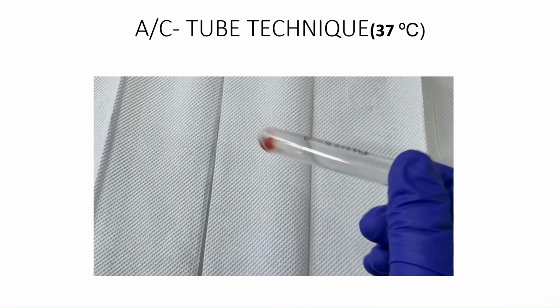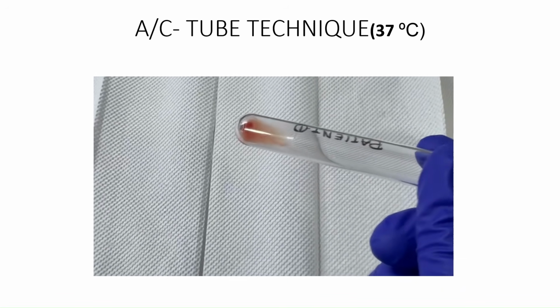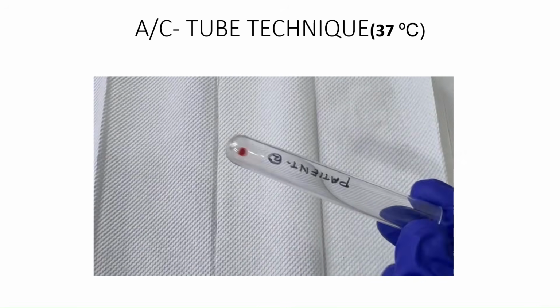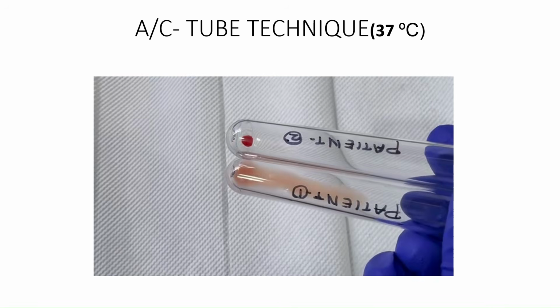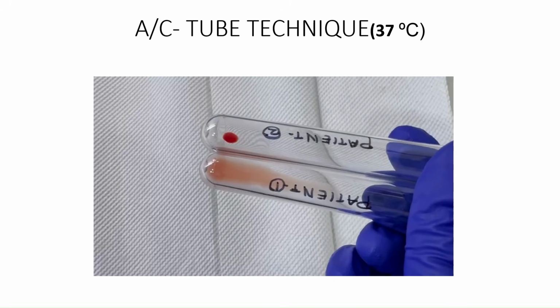So after centrifugation, here we can see in patient 1, the autocontrol is negative, and in patient 2, the autocontrol is 4 plus positive even at 37 degrees Celsius. So here we can see at 37 degrees Celsius also patient 1 has negative autocontrol and patient 2 has positive autocontrol.